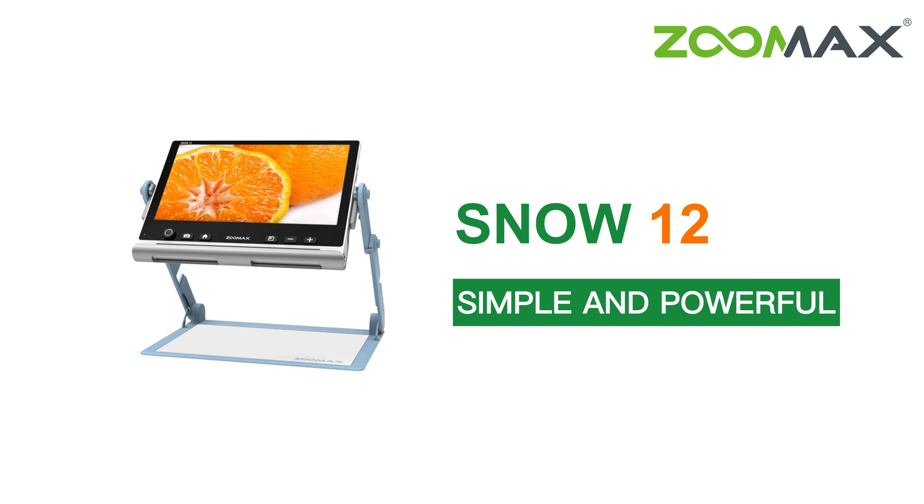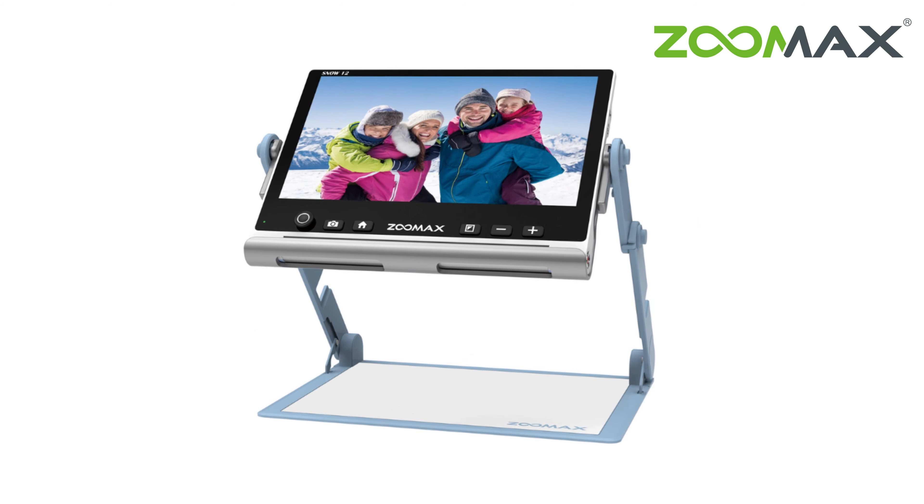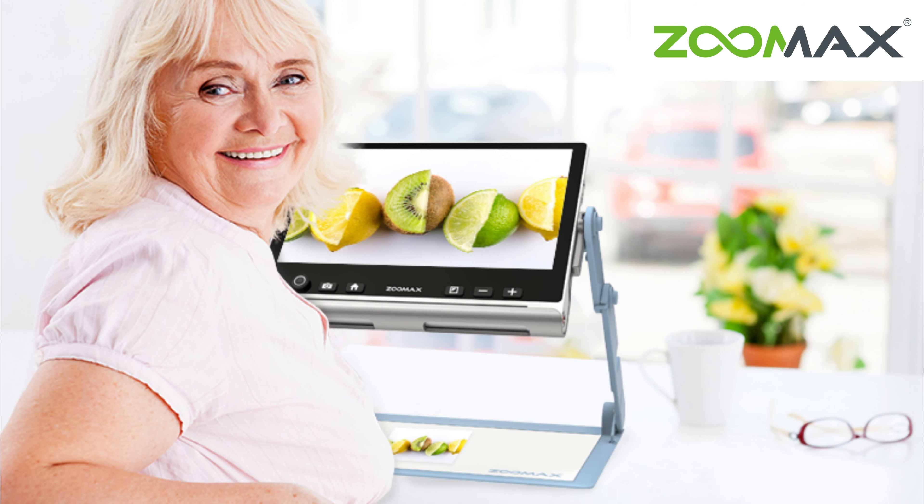Zoomax Snow 12 is a portable electronic magnifier with powerful functions and easy-to-use features. It always satisfies users' different needs.